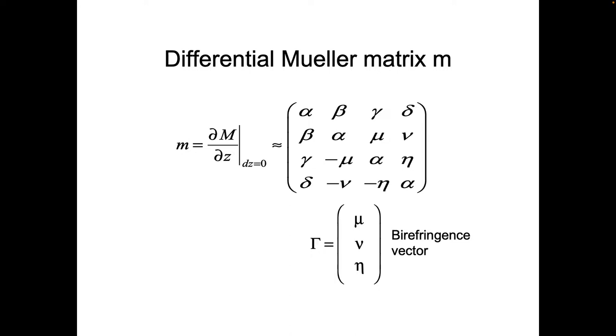Okay. I'm just thinking for a second. See, we went from the Jones matrix to the Mueller matrices. Yes. Then we take a derivative. I can see why you take the derivative so you can see change. But why change to Mueller matrices in the first place? Because they cannot really carry more information. The information should already be in there.